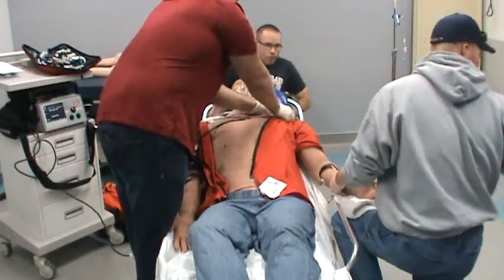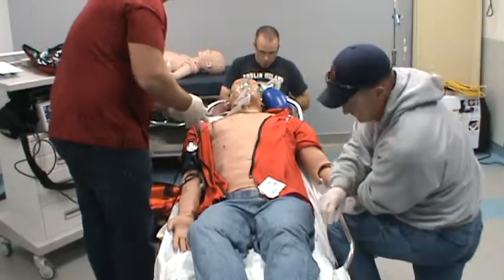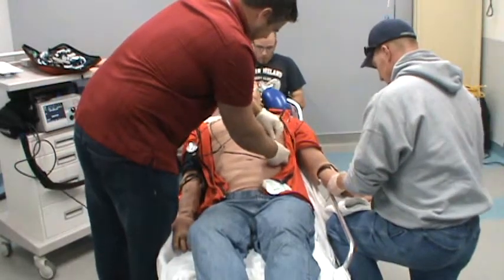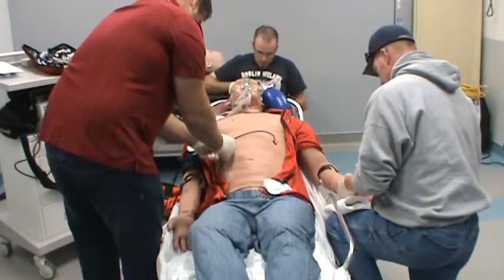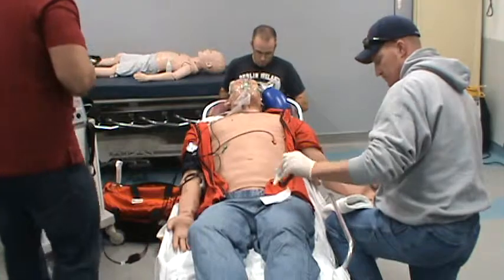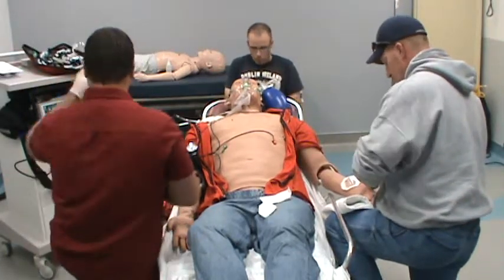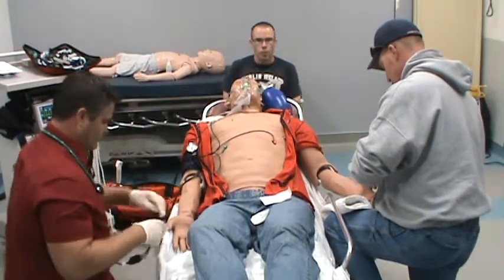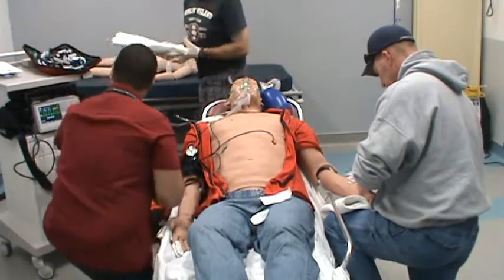Alright, so Frank, just leave me enough room on that table over there. I'm going to start setting up all my airway adjuncts over there. Check my combi tube here and make sure that's good to go in case we enter in a failed airway. Heart rate looks to be 125. Put the pulse ox on? Yes, please. Put the pulse ox on and let's go ahead and pull the end tidal out and get that warming up so that's ready to go.